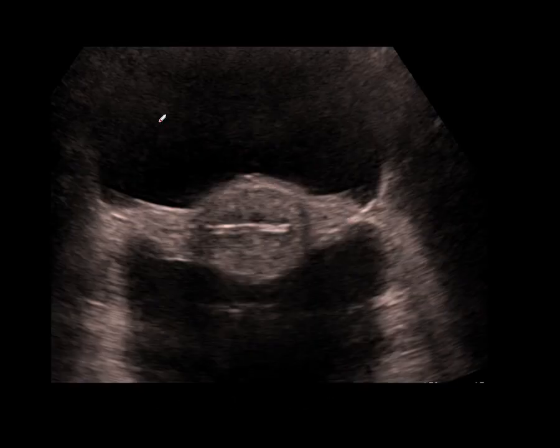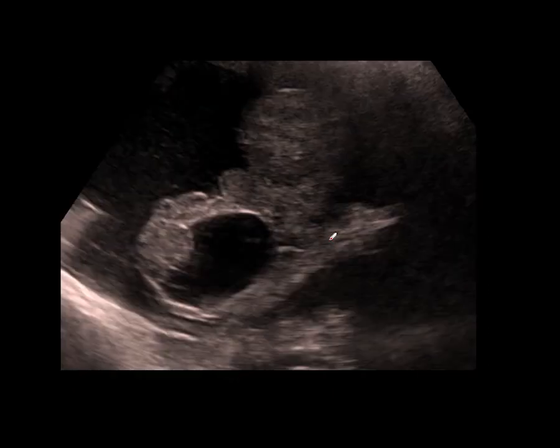Here's a patient who's also got ascites. Here's some ascites anterior to the uterus, and we've got some posterior. Here's an intrauterine contraceptive device, the transverse portion, and these are the broad ligaments. So what would you think about this patient's ovary here?